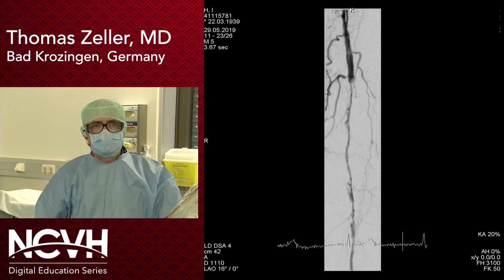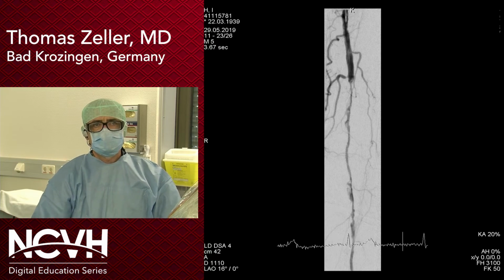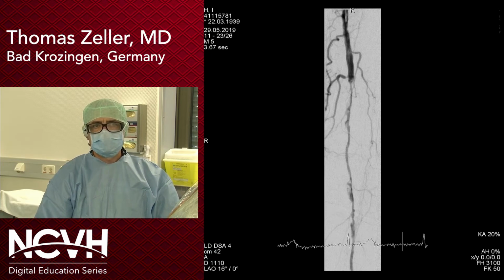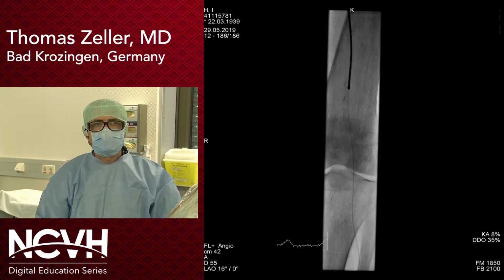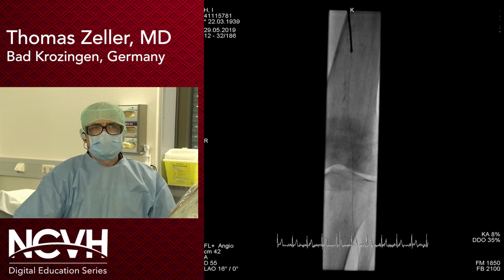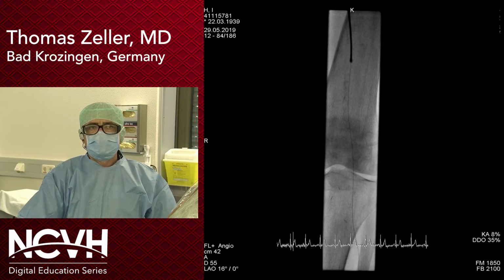And what you may see here is that there is some thrombus in the middle part here of the popliteal, and just proximal to the occlusion, there is the Phoenix atherectomy catheter already in place, which I was using then to cross the lesion twice. So the Phoenix atherectomy catheter is a front-cutting device. Here I did choose the 6-French system because I didn't want to change to a 7-French system due to the antegrade access in an operated groin.